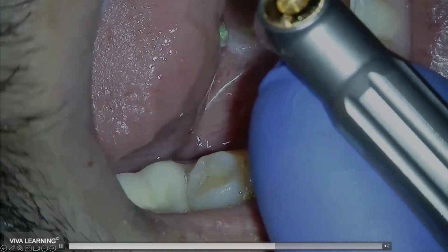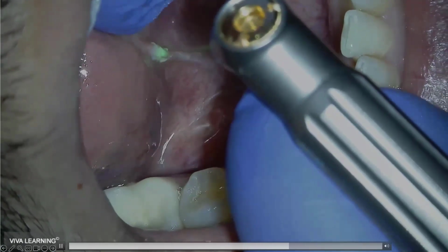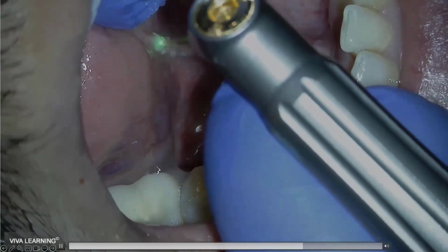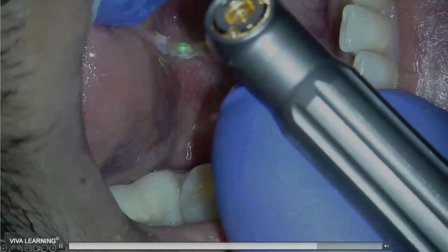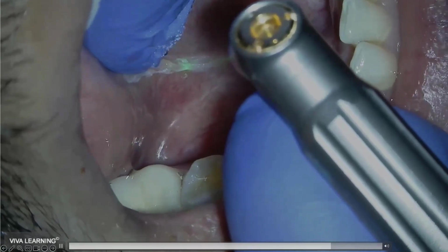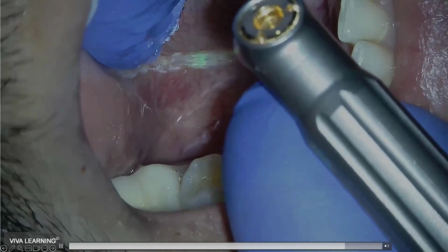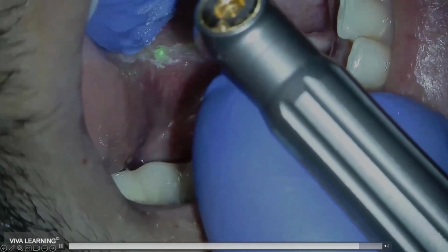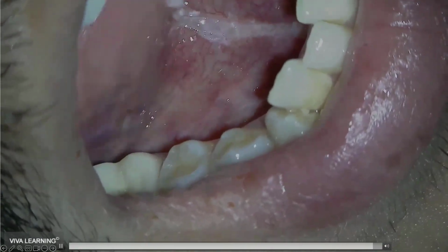Now, the question just came up, is anesthesia done during this? I think with this one, we did a compounded topical. Again, back to what we talked about at the beginning, the big idea with restorative procedures is that with teeth, I can do things anesthesia free. When it comes to surgical procedures, the rule of thumb is the deeper I go, the more likely I might need some level of anesthesia, right? The big idea being that I have something that cuts better and heals faster. Like this frenectomy is going to be healed in about 2 or 3 days, right? And no bleeding, easy to do. The technique is simple. I'm pointing at it to cut it, right?